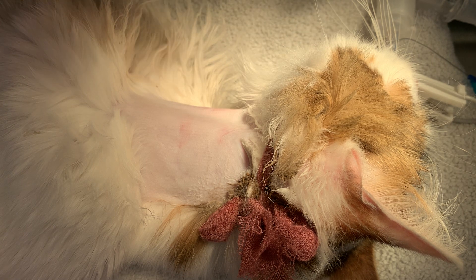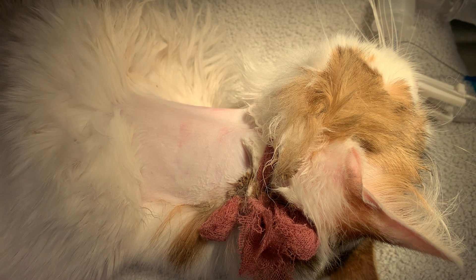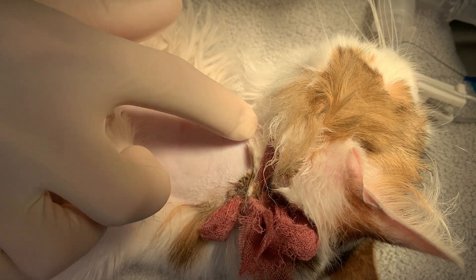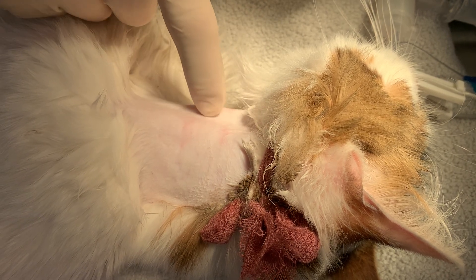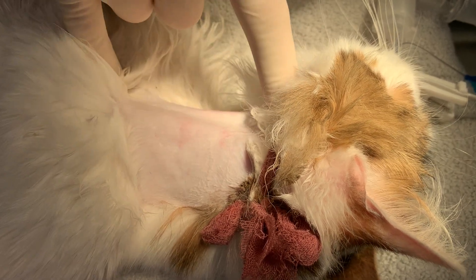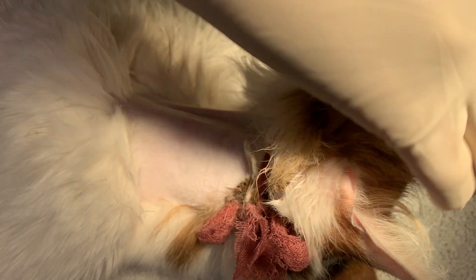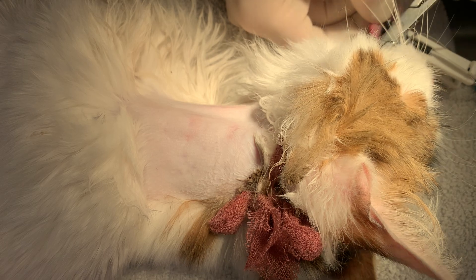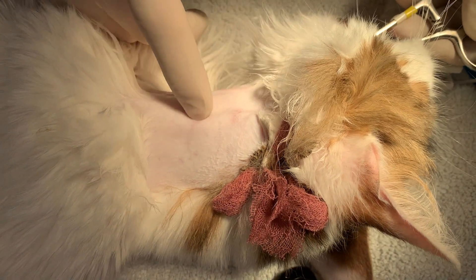You can place this on either side. Most people will put it on the left because the esophagus is on the left, but you can technically place it on either side. I'm going to put a little lube on these carmalts because it often slides into the esophagus a little easier that way. We want to place it ventral to the wing of the atlas, above the carotid and jugular — dorsal to those structures — and somewhere halfway between the angle of the jaw and the thoracic inlet. We do this with the patient anesthetized and intubated, so it's really hard to put it in the wrong tube.